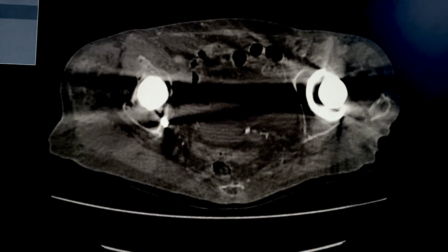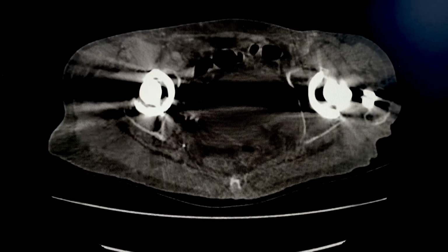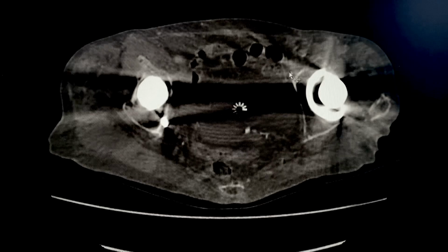Our setting is on bone setting, which allows us to see the blood vessels contrasted, and we can see here the calcific changes in the left common femoral artery. We can also see that the common femoral artery is occluded.